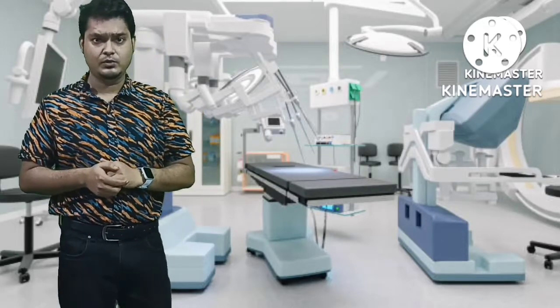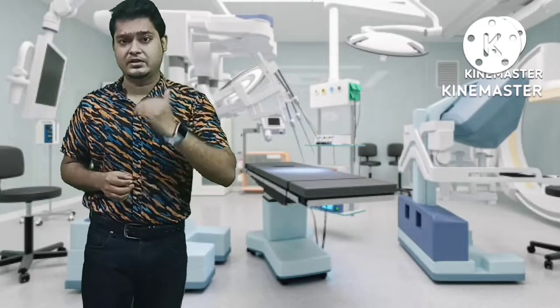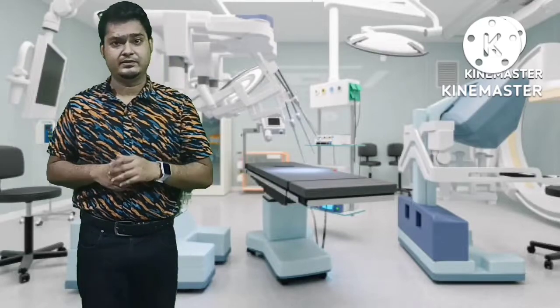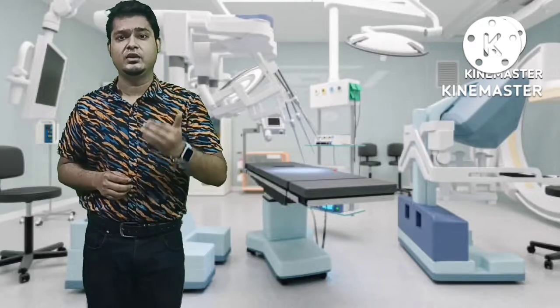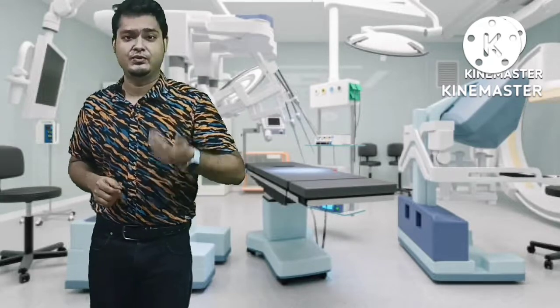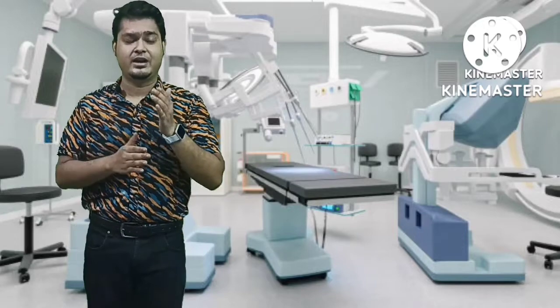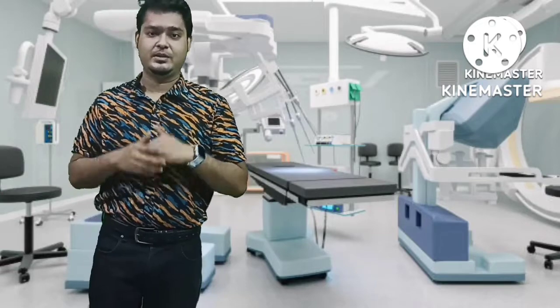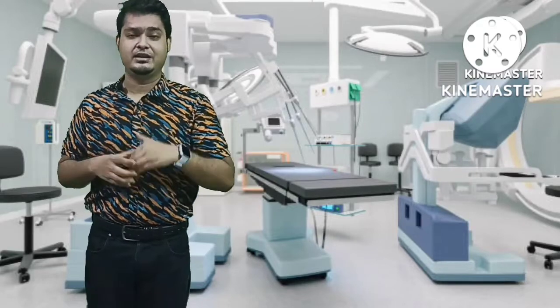First, we are going to discuss how we will prepare the patient for CT coronary angiography. If the patient comes to us for CT coronary angiography, then to prepare the patient, we will do the following things. First, we have to take the history of the patient. We will ask whether the patient has had any kind of contrast reaction, any kind of allergy, or allergy to any food or medications. We will ask whether the patient has had any surgery or other tests. If the patient has many tests, we will instruct the patient to bring all the test reports on the day of the examination.